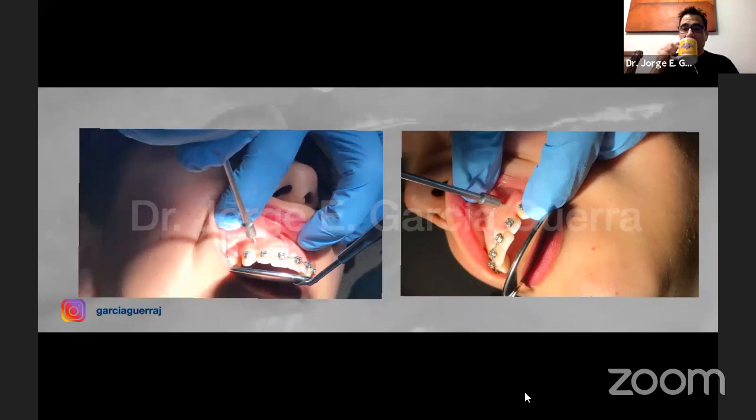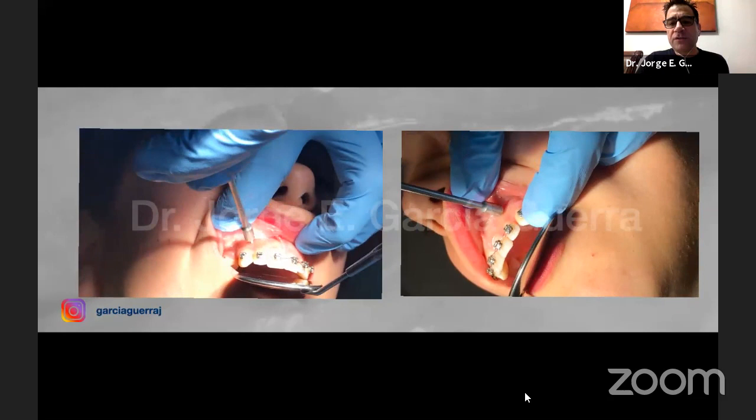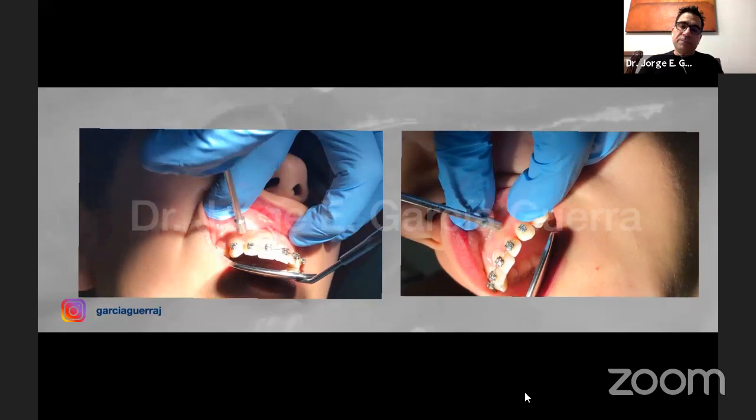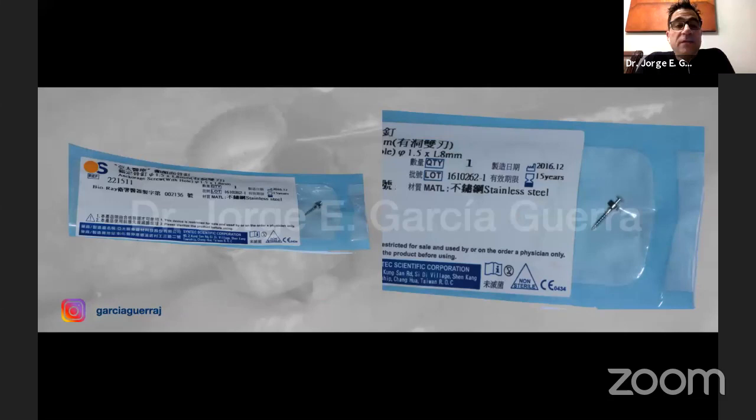Now you can see how easy it is. It's very fast. And I use the big mirror so I can visualize it. First, obviously I took an x-ray prior to that and I always take x-rays at the end of the insertion. But I like to show these videos to my students or when I do a lecture so you can see how easy it is. It's very fast. You take more time putting the anesthesia on the patient. This is the Bioray mini implant. You can see it's 1.5 by 8 millimeters long.